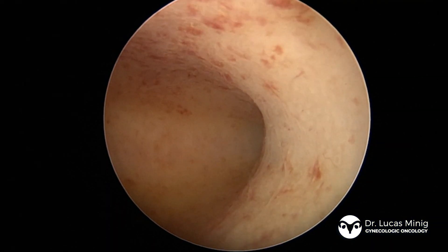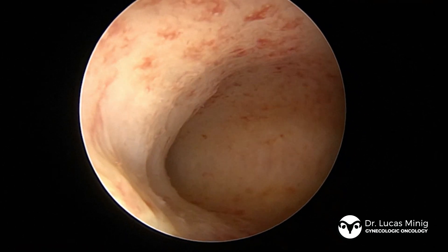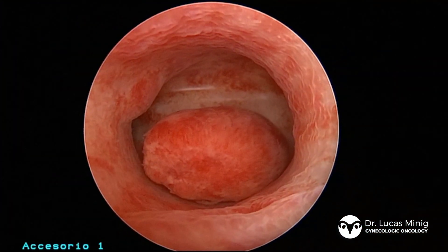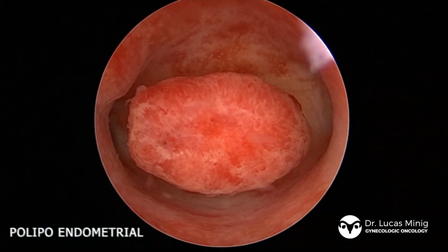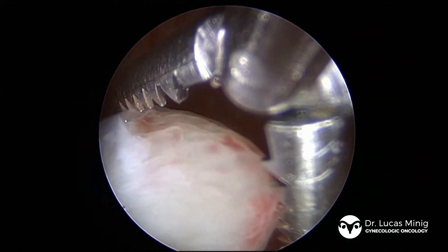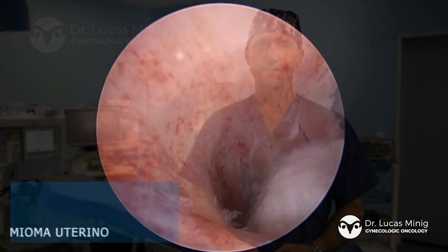As you can see here, the uterine cavity with two ostia — the two orifices that communicate the endometrial cavity with the fallopian tubes on each side — this is a totally normal view of the endometrial cavity. Here, on the other hand, we can see a polyp in the endometrium, which is one of the most frequent findings. A small instrument can proceed to its removal, whether for polyps or myomas, or to take a direct biopsy in areas where we suspect a tumor in the endometrium.